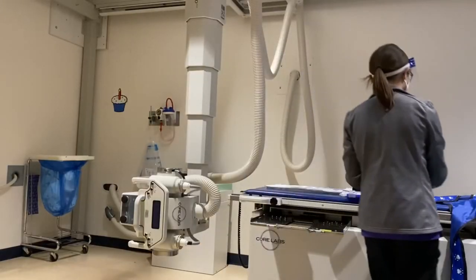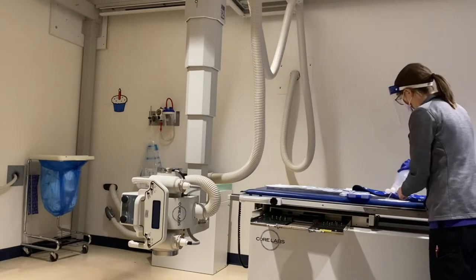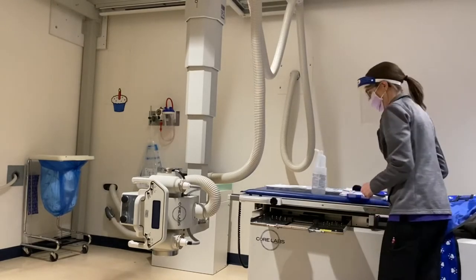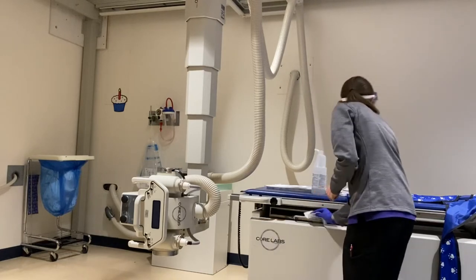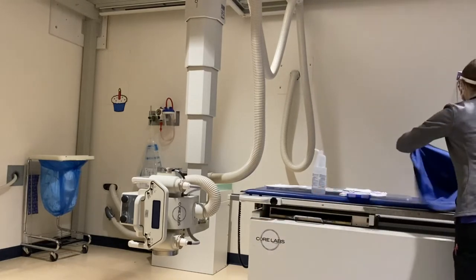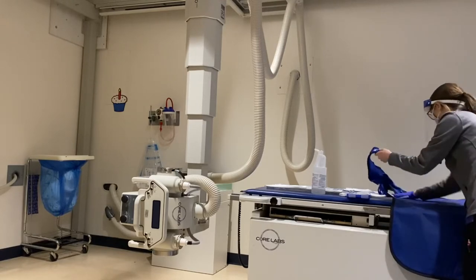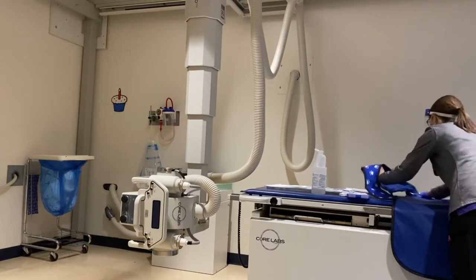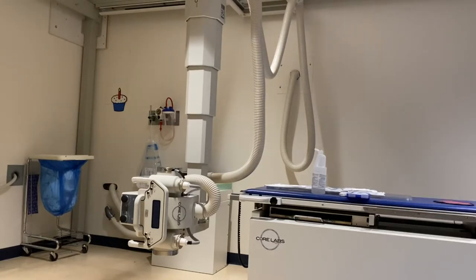That exam did not go as expected. The child was a little bit older — not old enough that I would have them stand — but the parent refused to have them lay on the table, as he's had x-rays before and had a bad experience with being on the table. So I worked with the parent and we had them stand at the wall bucky, which is why the tube is facing towards the left there over to where the wall bucky was.